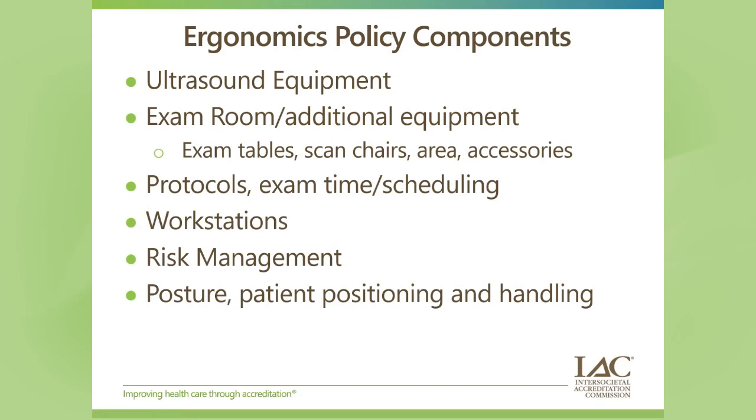The other aspect is the exam room and the additional equipment in that, meaning things like our exam tables or the scan chairs. The area itself: is your room adequate for all the equipment that you have in there? And then different accessories that you might choose to use or your employer might provide for you.